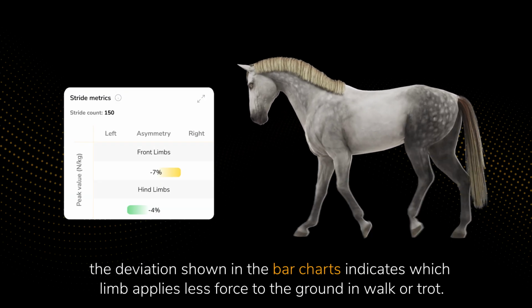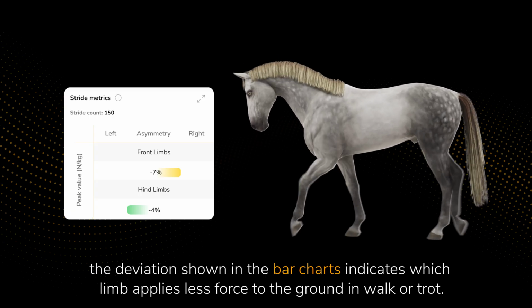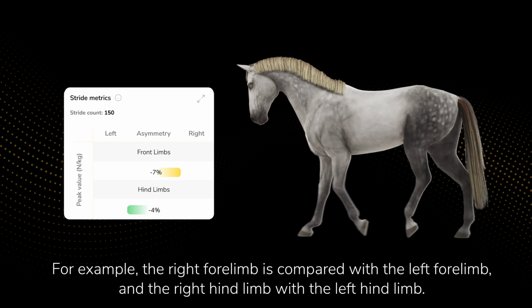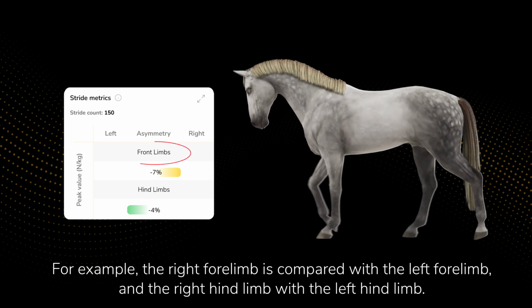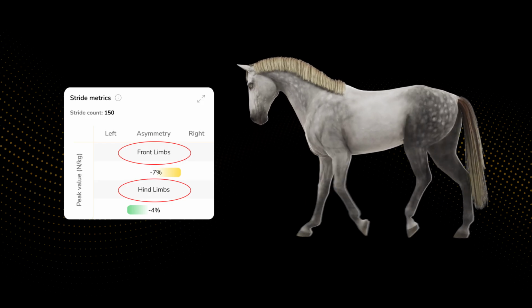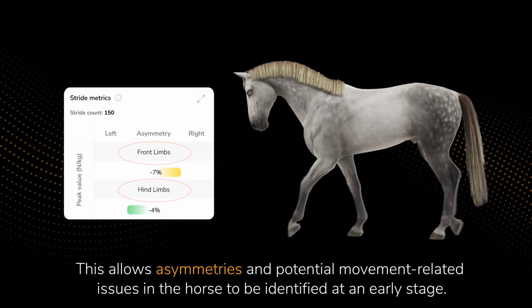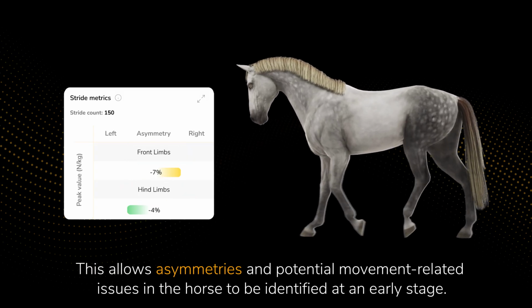The deviation shown in the bar charts indicates which limb applies less force to the ground in walk or trot. For example, the right forelimb is compared with the left forelimb, and the right hind limb with the left hind limb. This allows asymmetries and potential movement-related issues in the horse to be identified at an early stage.